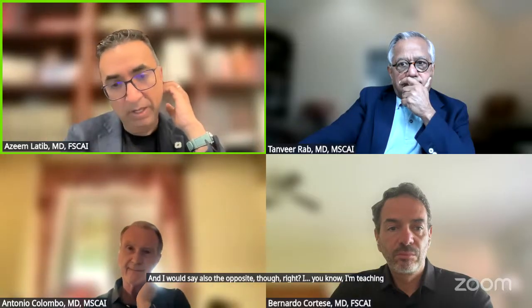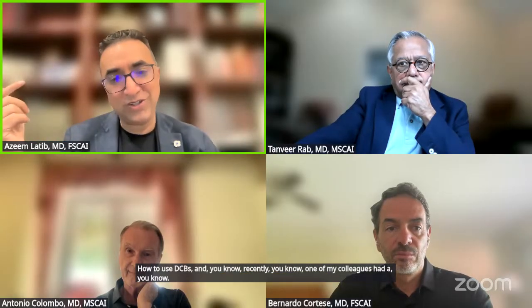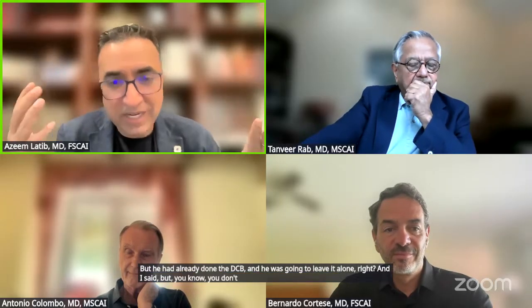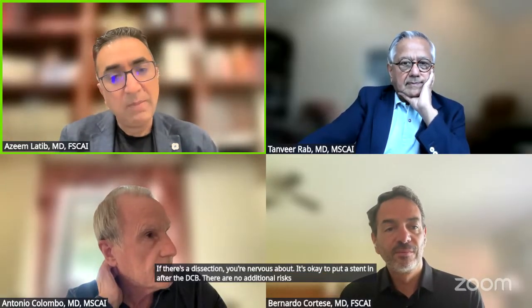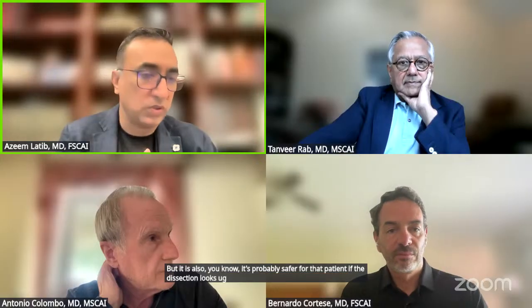And I would say also the opposite though, right? I'm spending a lot of time, like Bernardo's doing, teaching my colleagues who work with me how to use DCBs. Recently, one of my colleagues had a long dissection, but he had already done the DCB and he was going to leave it alone, right? And I said, you don't have to feel bad about putting a stent in either. If there's a dissection you're nervous about, it's okay to put a stent in after the DCB. There are no additional risks from the double drug, and it's probably safer for that patient if the dissection looks ugly or looks concerning.